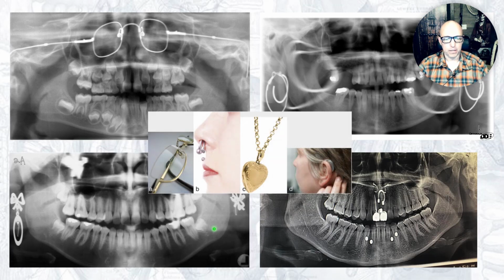Yeah, if possible, have patients remove all of these things. Hearing aids as well, but that shouldn't project over at least our diagnostic area. I wouldn't say that's as crucial as some of these other things.